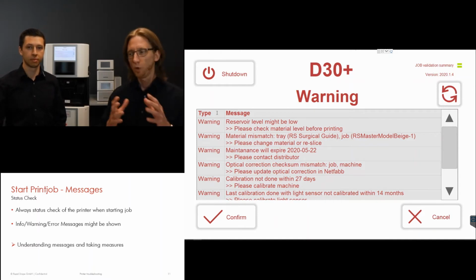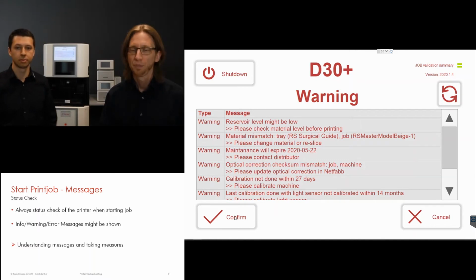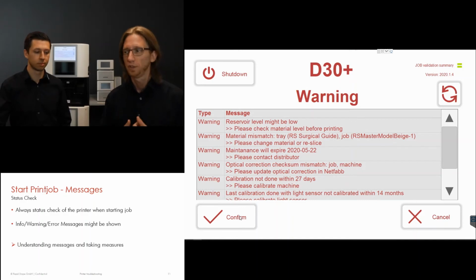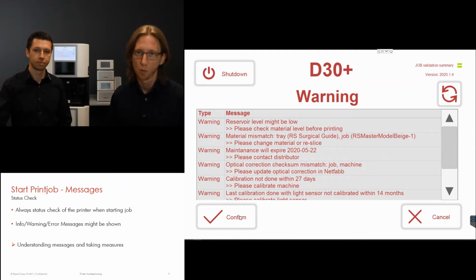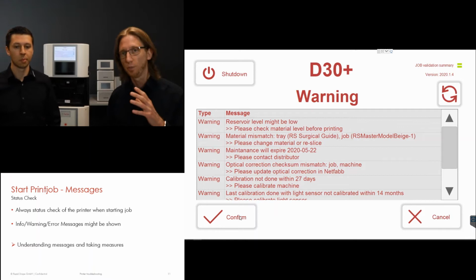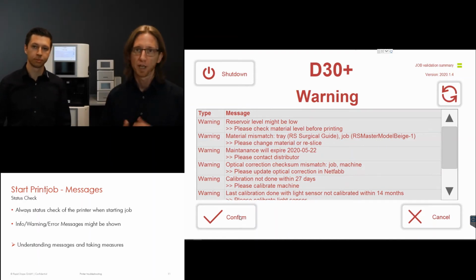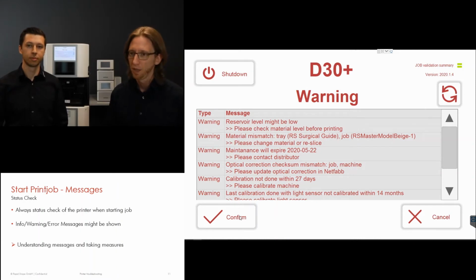So with a warning message, you can still, as you can see on the screen, there we have the confirm button, which means yes, you have recognized, you are aware of the message on the screen, but you are totally fine with that, and you still want to print this job. This is something you can't do when you have an error message and you have a Straumann machine. So this is something which is there just to make sure that we are always working in a validated workflow, in a validated environment, to have the best possible experience for the customer. So let's just go through these messages step by step.